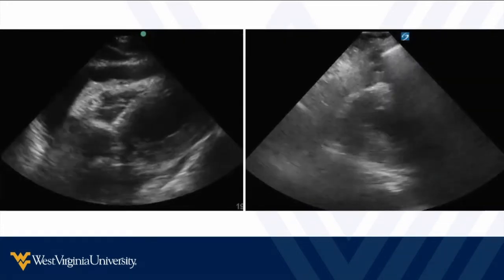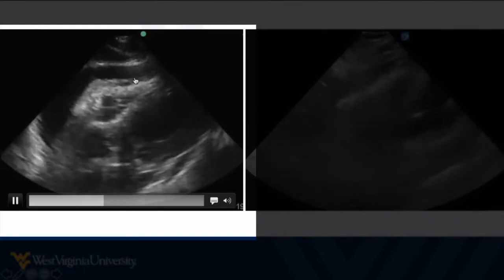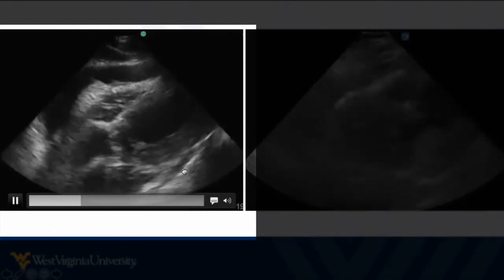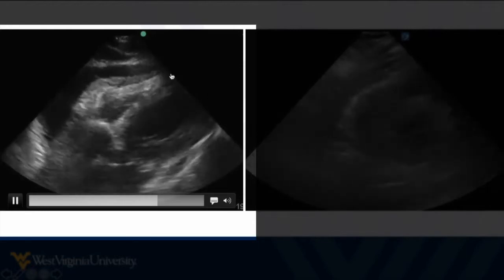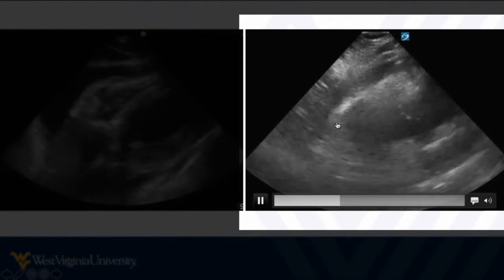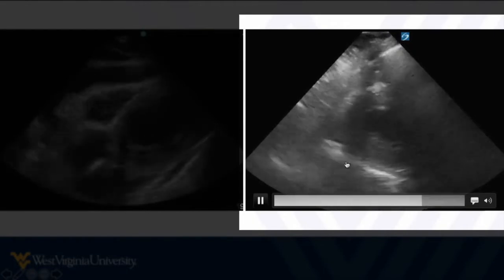These are effusions. Here we see blood. It's pretty black here. There's a lot of shape change throughout the cardiac cycle. There's a little bit of it posteriorly, so it's circumferential. That's always a big clue. And same here, we see fluid in different parts of it. We see some of the fluid wrap around the back.